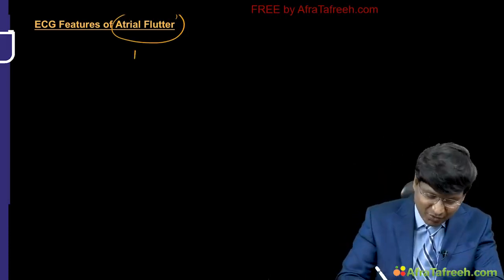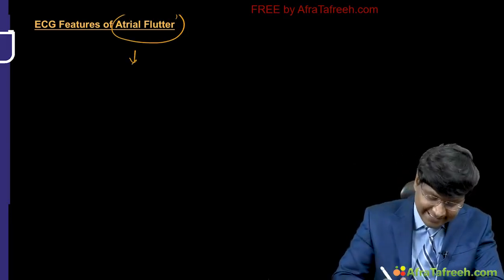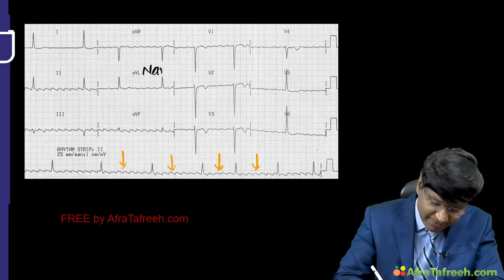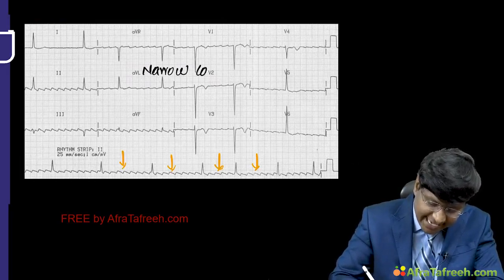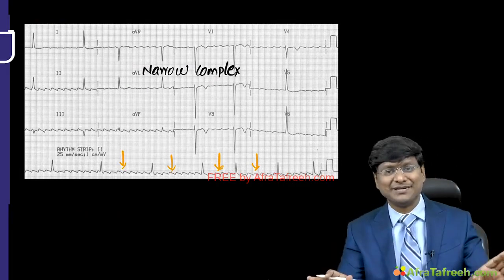So remember, what will be the ECG features of atrial flutter? Atrial flutter is a narrow complex tachycardia. It is not a wide complex tachycardia. It is a narrow complex tachycardia. Narrow complex in the sense that the QRS complex is normal.